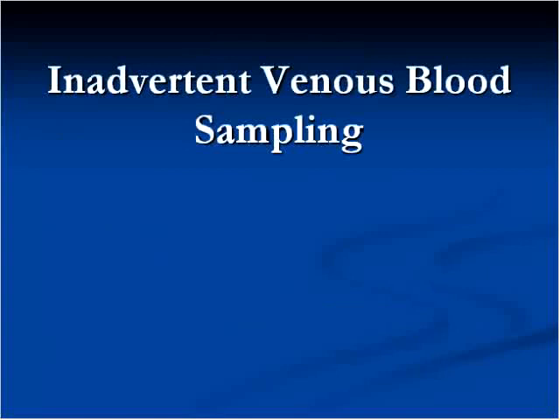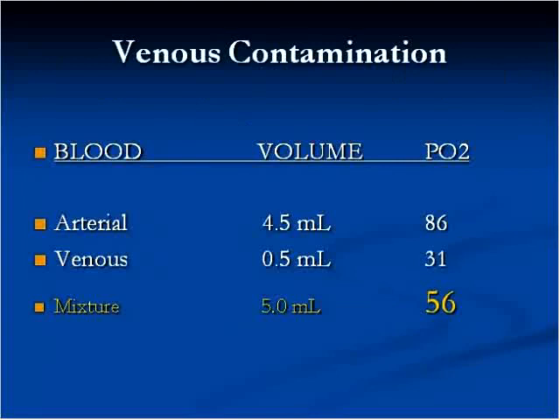Well, that is true of mixed venous blood. So if you drew it from the pulmonary artery, those would be the results you would be looking for.